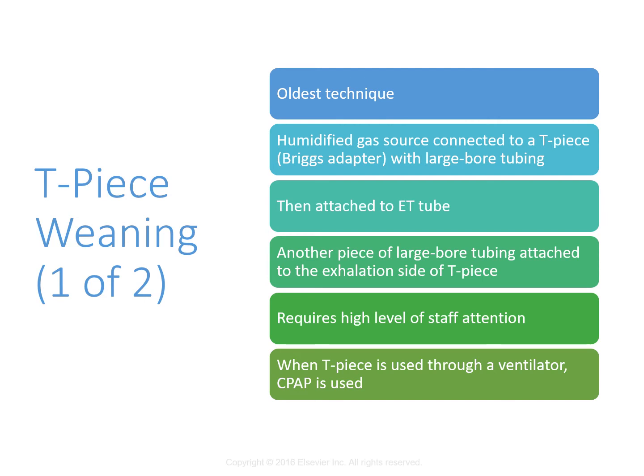The disadvantage is their effort to breathe through the ventilator circuit might increase their workload of breathing, so they're going to work harder to breathe. So a lot of the newer ventilators, thank goodness, usually provide a bias flow through the system and flow triggering that really helps reduce that workload on the patient's work of breathing. So it's very similar to a small amount of pressure support with the bias flow that goes through a lot of these circuits.